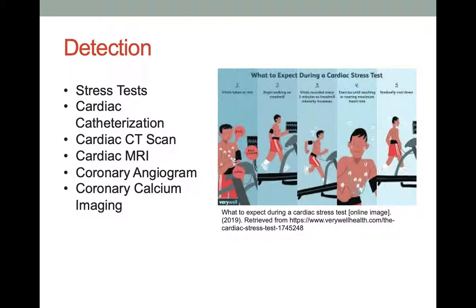non-medical reasons. But with the stress test, what normally happens is the person either runs on a treadmill or an exercise bike, and as the test goes on, the task gets progressively harder. They increase the rate or the incline or the tension on the bicycle. And as they're doing the test, the person is connected to an ECG, and that's continually running.